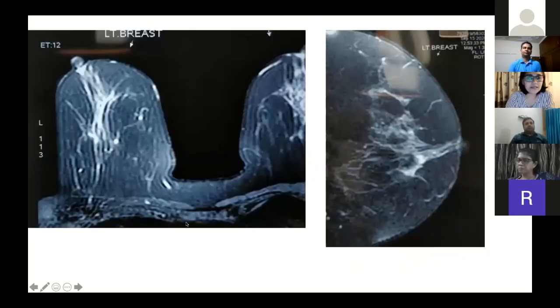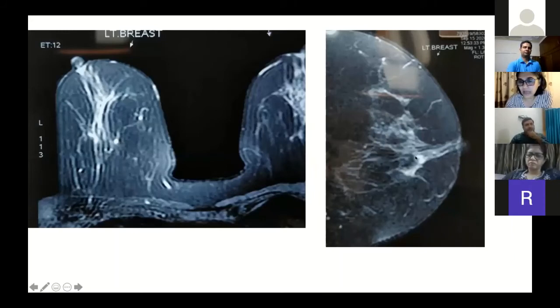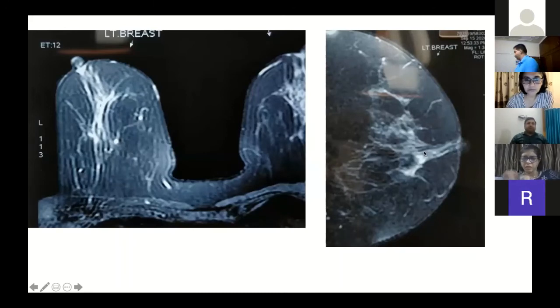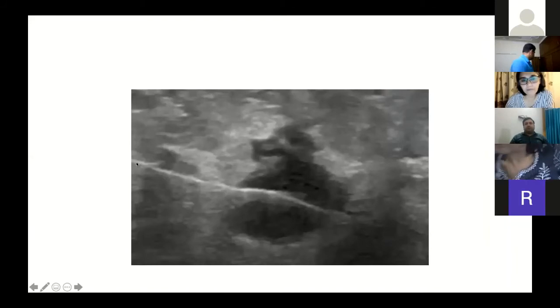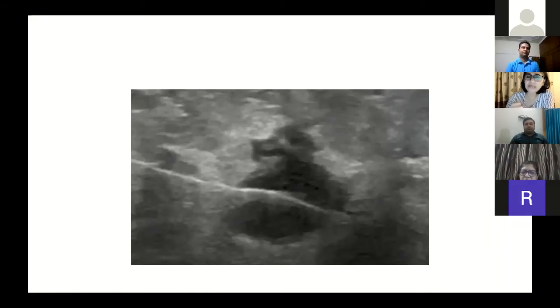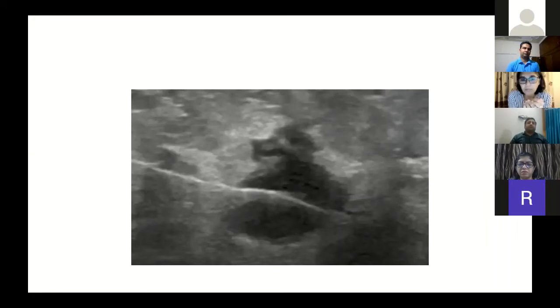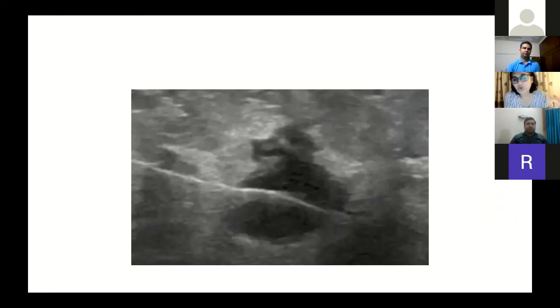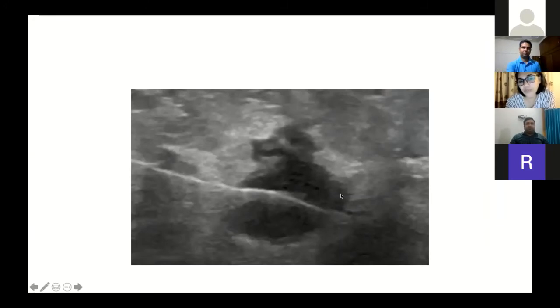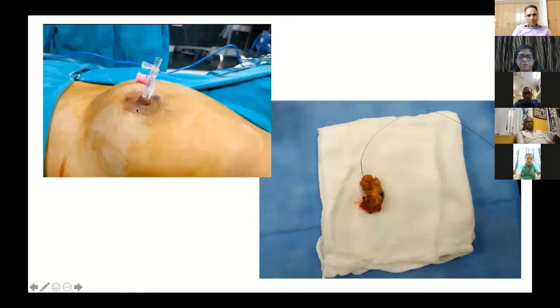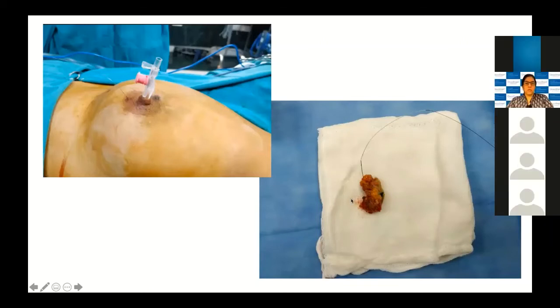Here is another case — an MRI of the breast showing a dilated duct with an enhancing intraductal nodule. This is the lesion and this is the hook wire. I generally like to go parallel to the chest wall, though a perpendicular approach can also be used. There is very little likelihood of really injuring and going right up to the chest wall, but preferably use a plane parallel to the chest wall unless the surgeon requests a perpendicular route. The hook wire has traversed one margin of the lesion. This was a small dilated duct with a nodule inside — a small papilloma — and you can see the hook wire is still inside.